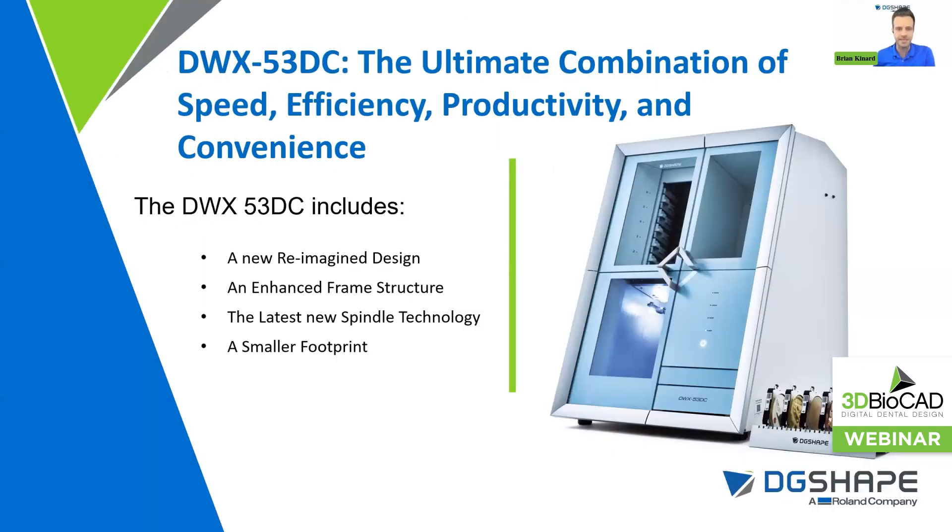The DWX 53DC is the ultimate combination of speed, efficiency, productivity, and convenience. The overall chassis has a brand new reimagined design with a smart dust evacuation system, an isolated milling chamber, and simplified faster puck changing. There's an enhanced frame structure with a solid body design, which results in less rocking and vibration when the spindle is applying high torque and RPMs to PMMA and different types of denture resins. This will result in predictable positive outcomes that you expect from Roland.